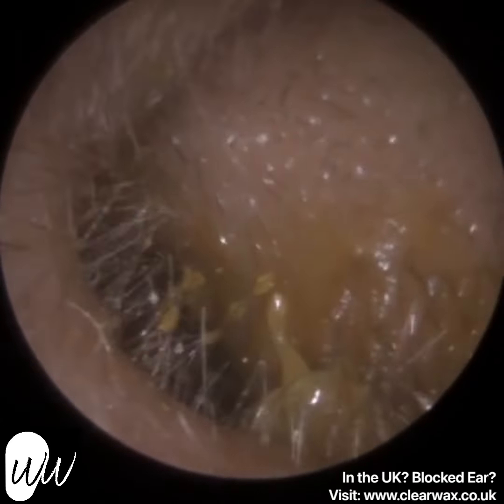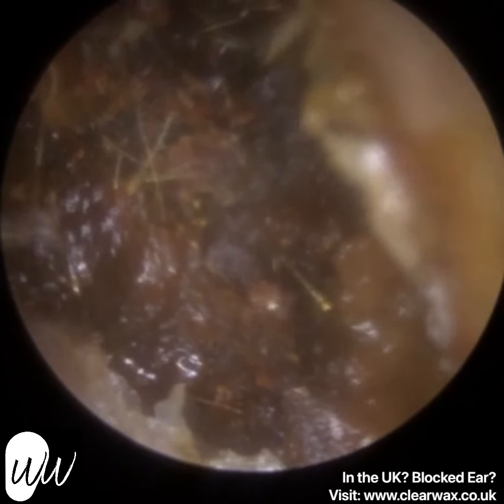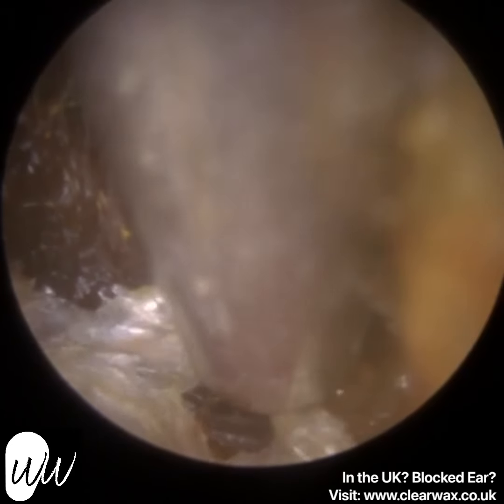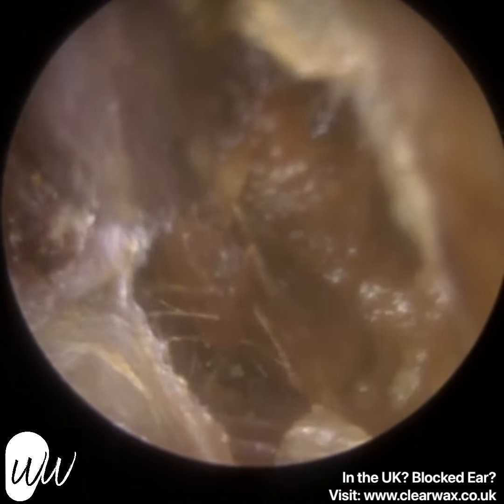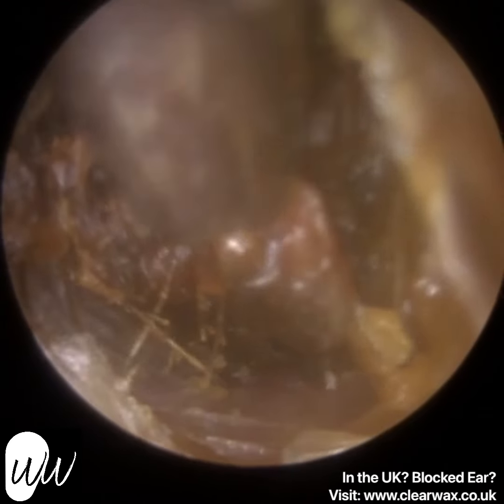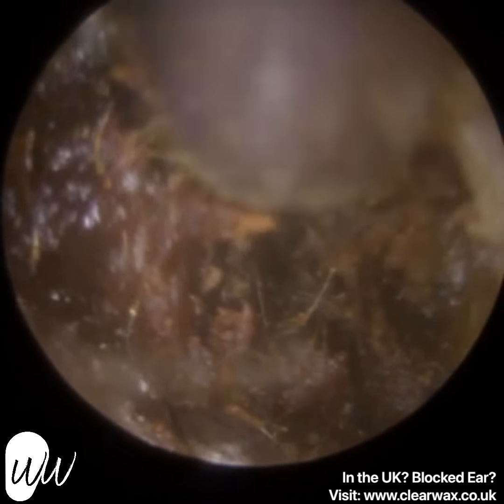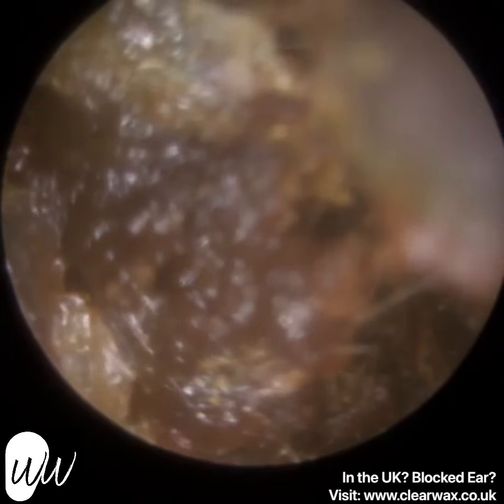I'm just going to clean the lens there. I just want to avoid going through. Now, sometimes when you enter the ear, there's so much wax around the entrance that it can smear against the tip of the endoscope, causing blurriness. If that was the case, I normally clear the entrance first, but quite often I leave the entrance near the end, because as you're moving the wax out of the ear, it's going to smear that entrance anyway. So instead of doing it twice, it's best just doing it the once.